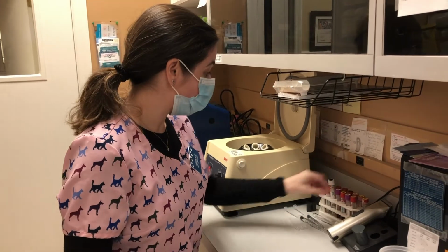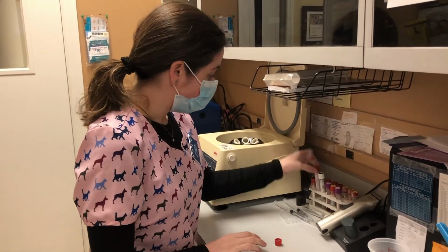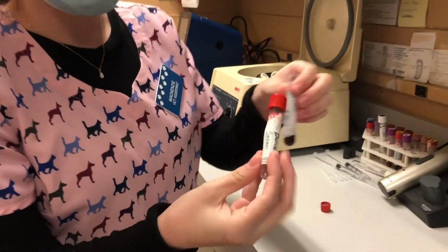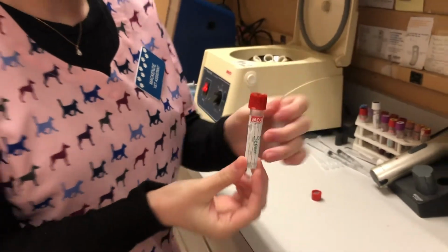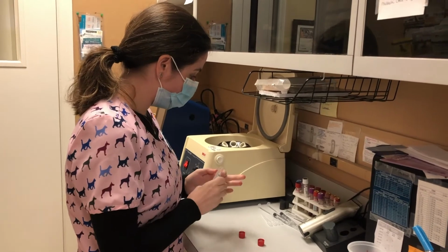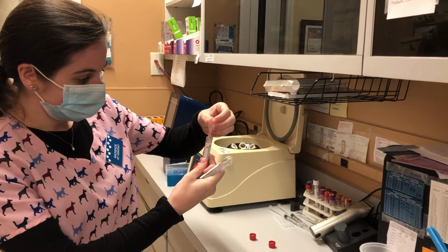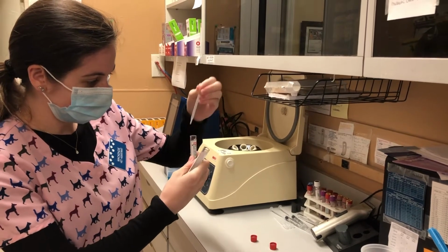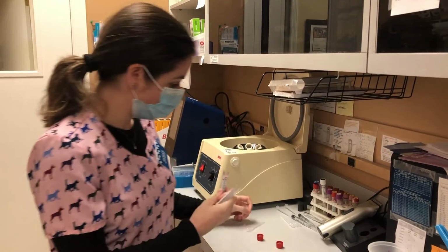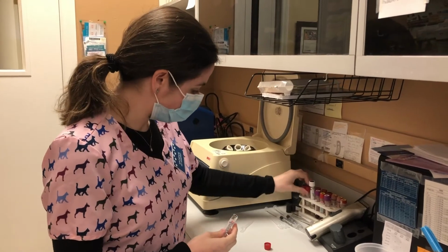Our first step is to take our serum from our clotted blood. As you can see, I labeled all of them so I don't have any confusion. So it's going into this tube, and we're going to put them to the side for later use. So that's our donor.